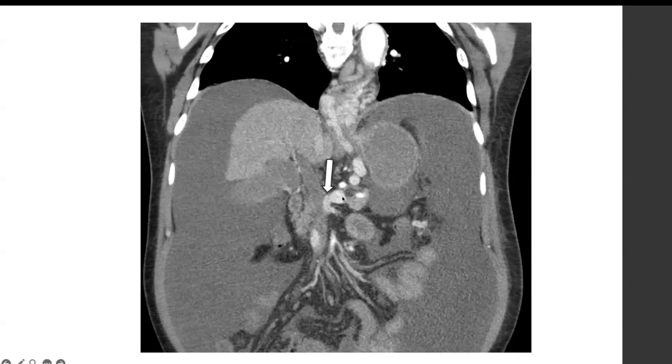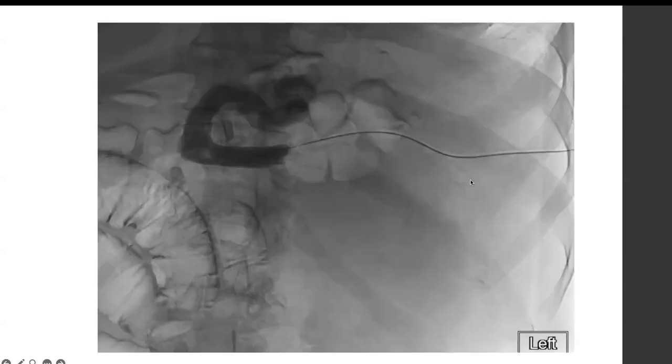So it's hard to see. The native splenic vein is open, and there's clot extending sort of subocclusively here into the SMV, and then the portal vein is out. But it looks relatively acute. So went transsplenic, because again, the splenic vein was open. So whenever the splenic vein is open, you know you have a decent shot of getting things reopened because that's the most common route to get access to the area of interest.